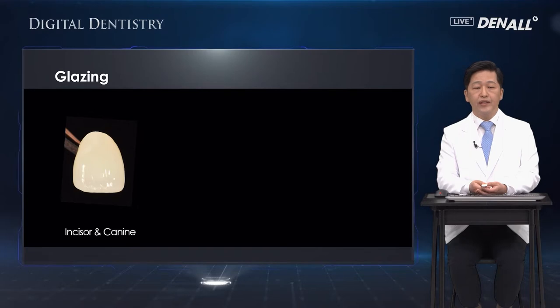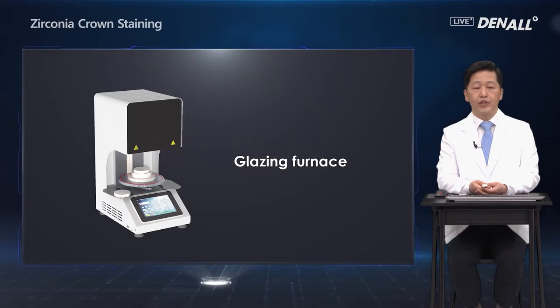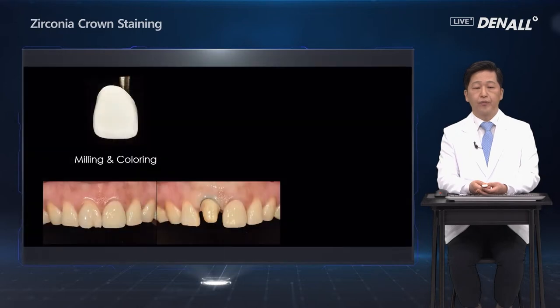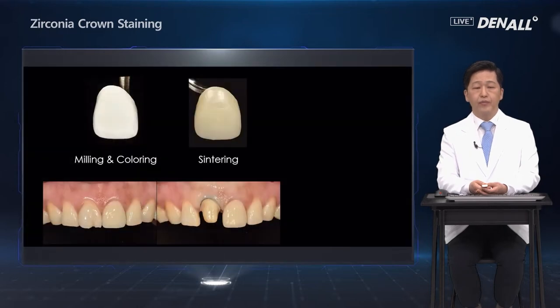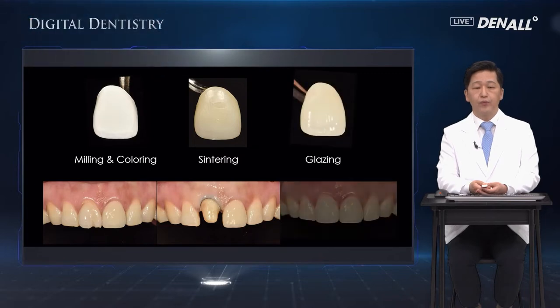Glazing of the anterior teeth is used to naturally smoothen the anterior teeth which require no further coloring. This is the glazing furnace which should be used. After milling, sintering is done, followed by glazing, and then it is attached to the teeth.